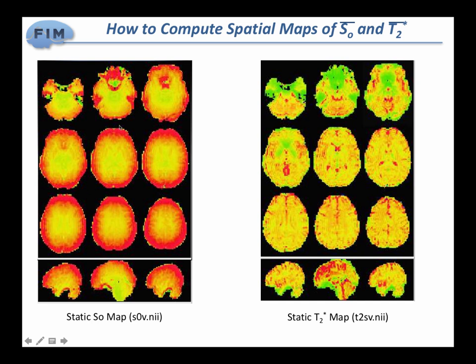Here you can start to see that, for example, this captures a lot of the intensity inhomogeneity across the brain, with the areas closer to the coils having more signal than the areas in the middle. Here we can see some anatomical structure because the relaxation time for the ventricles is much larger than, for example, for the white matter. In fact, for that I will refer you to the review paper that I showed at the beginning: some people claim that these T2* maps can be a good surrogate to do the alignment from the functionals towards the anatomical, because they tend to have very good tissue contrast. I honestly haven't tried myself, so I cannot tell, but it's something that's recommended.